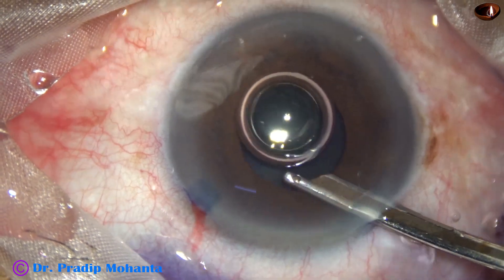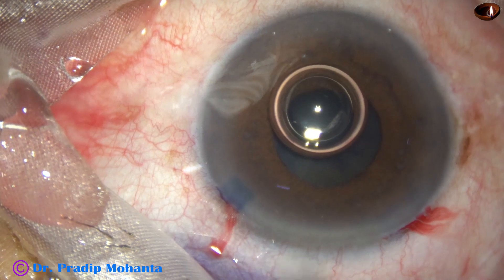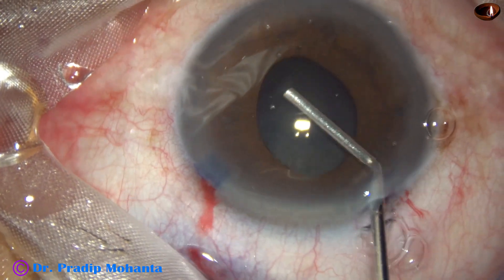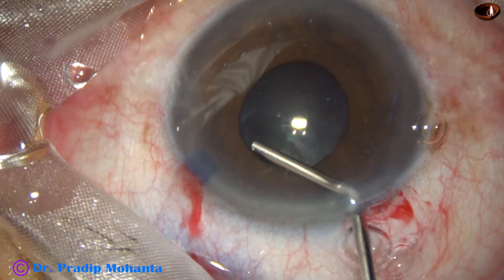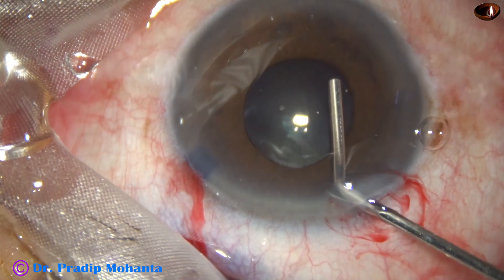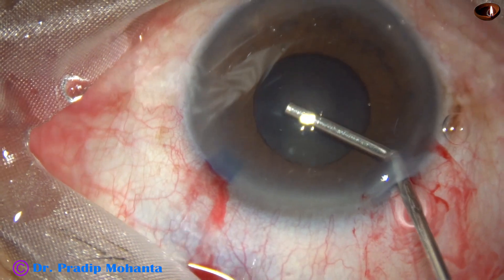Trypan blue dye has been applied under the iris. Both adrenaline and phenylephrine have been used, but the pupil does not dilate. The size of the pupil is about 3.5 to 3.75 millimeters — not enough to manage this black cataract. I am now injecting viscoelastic under the iris, and some over the iris, so that a space is created behind the iris.